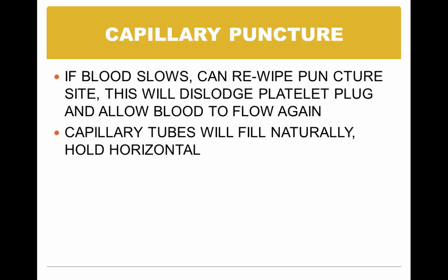Capillary tubes will fill naturally. You want to hold them horizontally. We'll show you that in lab. And we kind of showed you as far as wiping off the plug to try to get the blood flow to go again the other day with Katie.